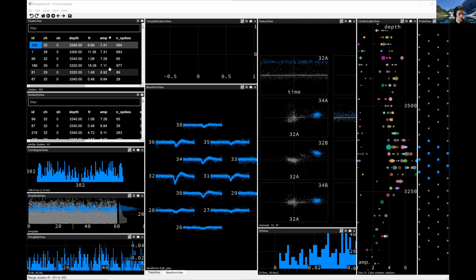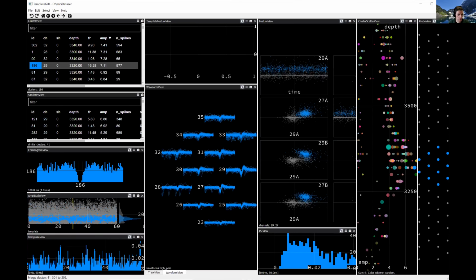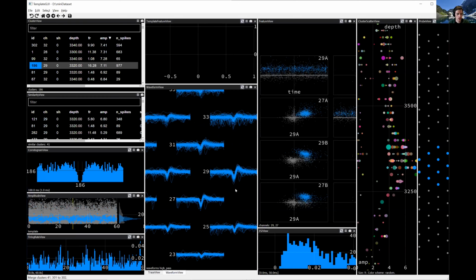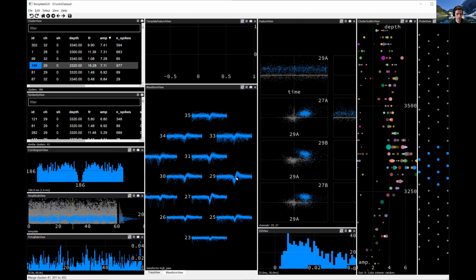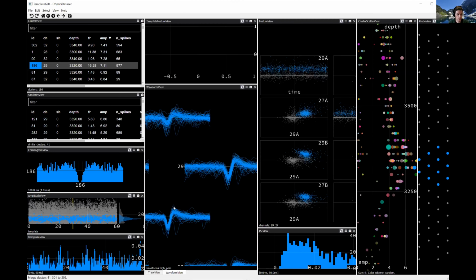All right, so let's pick this neuron. This neuron was the one we looked at with the high firing rate, and we can see the clean refractory period. So in Flora's chart, she suggests that we start with looking at the waveform. And I would say this waveform looks pretty good. It's not as high amplitude as the other one, but it's decent and it exists on multiple different channels. And the waveforms on the largest channels are pretty consistent from spike to spike.